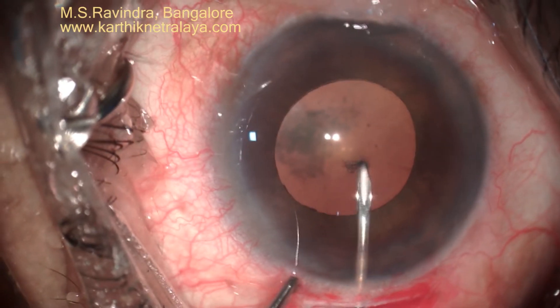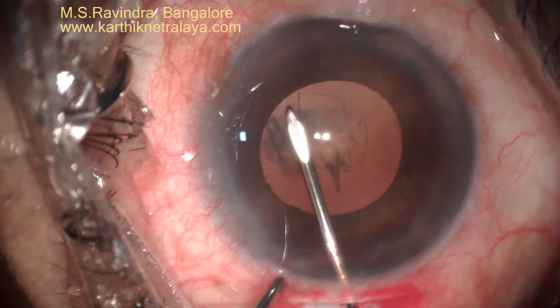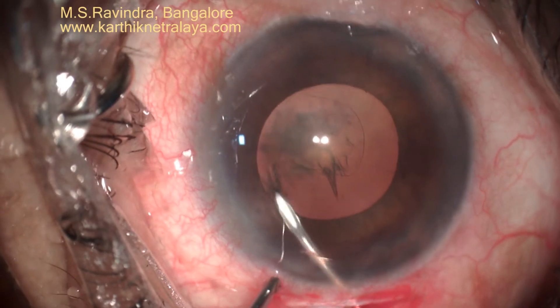The cystotome is taken through the floor of the tunnel so that the viscoelastic in the anterior chamber is trapped inside. It doesn't leak and doesn't shallow the chamber during rhexis.